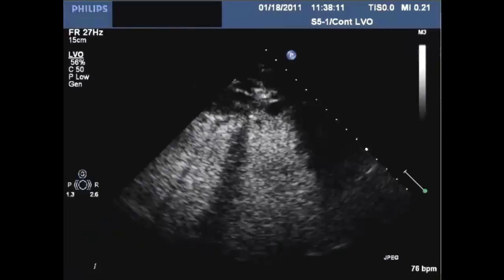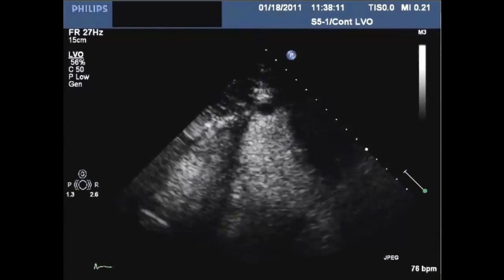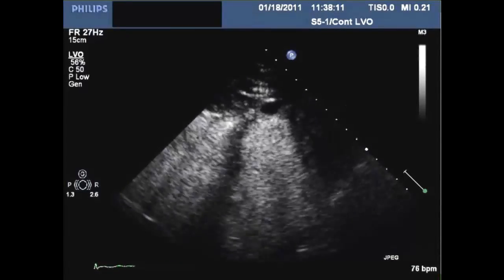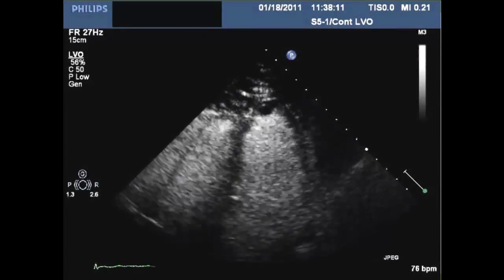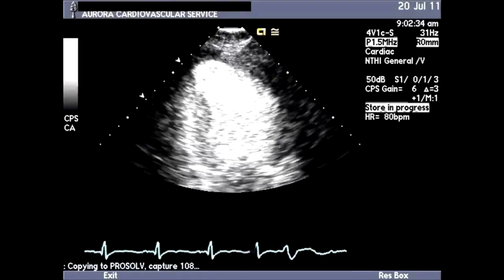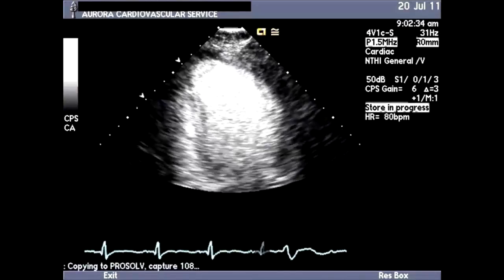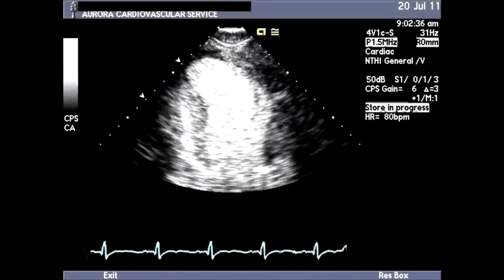Whereas case number 2, I can guess the sonographer used the contrast to define the endocardial border, and the apical thrombus was uncovered, probably surprisingly so. Small little apical thrombus. And case number 3, yes. I think this is a nice demonstration of contrast being used to distinguish between what we know now was just apical trabeculation and not a thrombus.